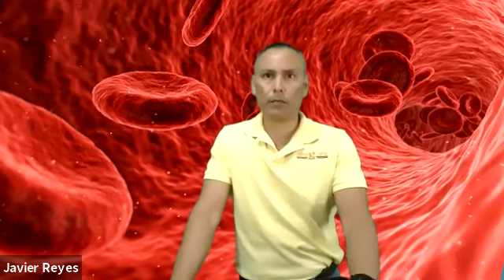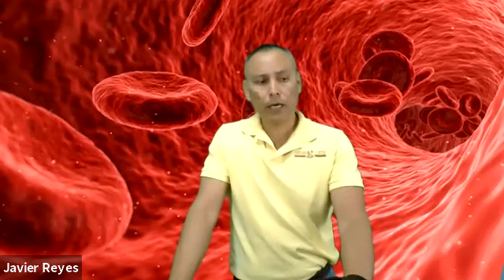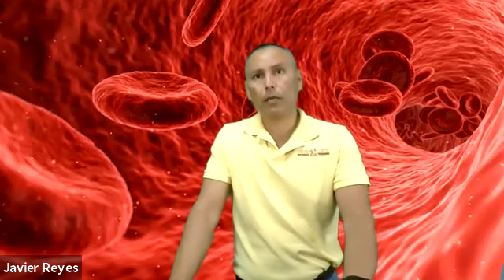You should maybe go away from it distally, or maybe more on the upper arm, right over it. But never close to the valve, because this will probably not allow you to collect any blood specimens, and you will probably damage the valve. So make sure that you don't poke anybody close to a valve.